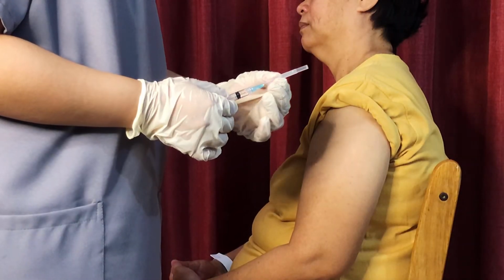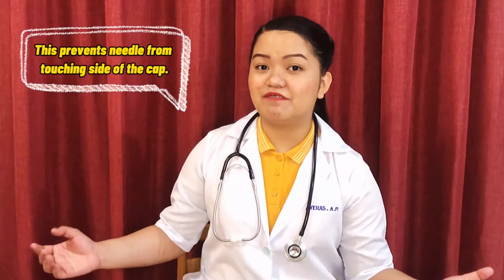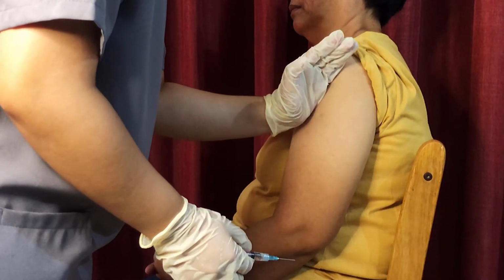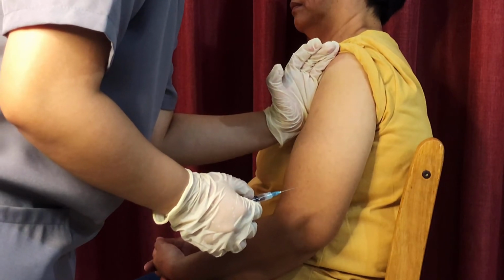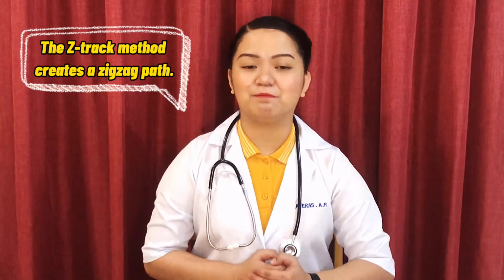Next, remove the needle cap by pulling it straight off the needle. This prevents the needle from touching the side of the cap, prevents contamination, and reduces risk of accidental needle stick injury. And then, displace the skin in a zigzag manner by pulling the skin down or to one side about 2 cm with your non-dominant hand. The Z-track method creates a zigzag path to prevent medication from leaking into the subcutaneous tissue.